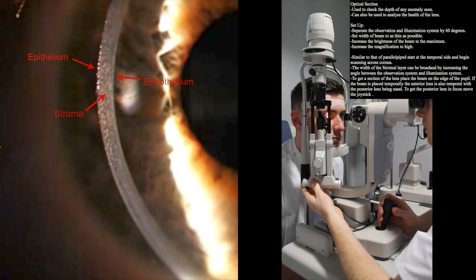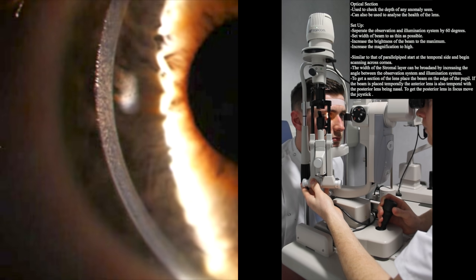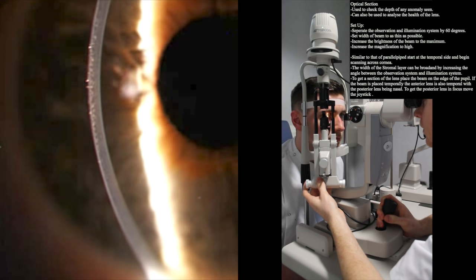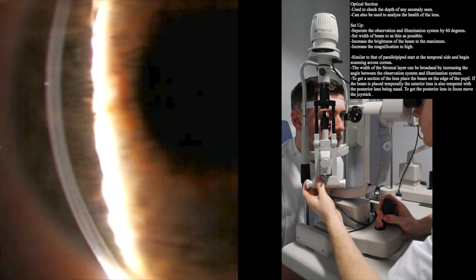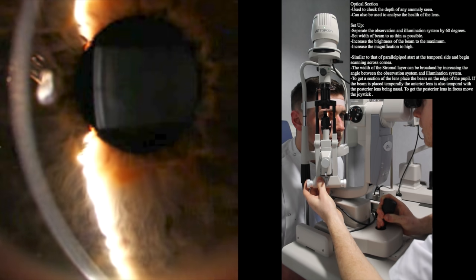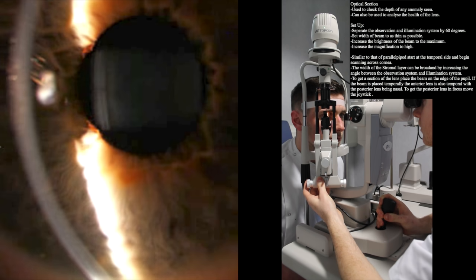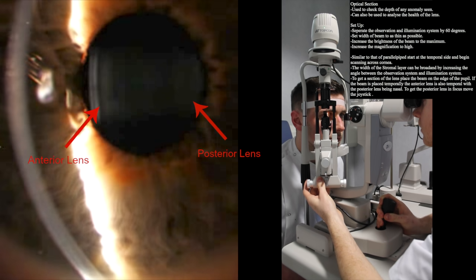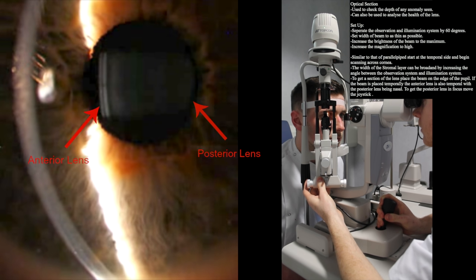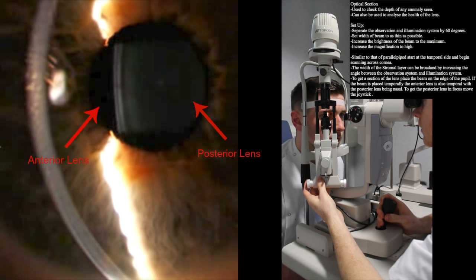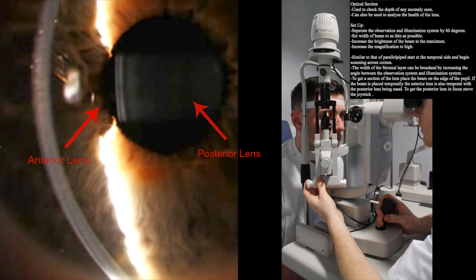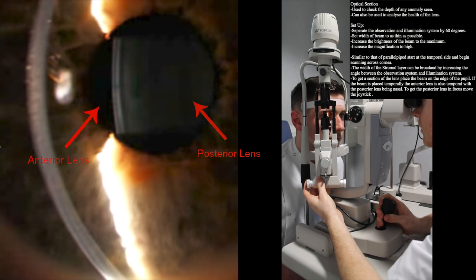A section of the lens can also be obtained using this technique. Move the beam over the pupil and a section of the lens can be found. If the illumination system is positioned temporally, the anterior lens is also viewed temporally with the posterior lens being blurred nasally.